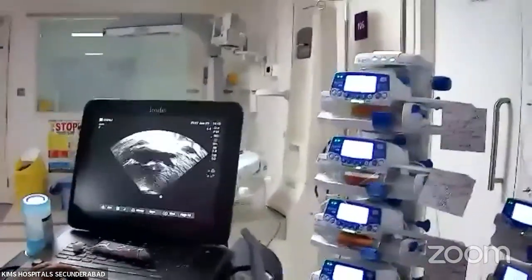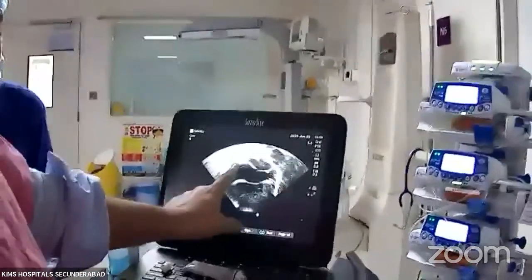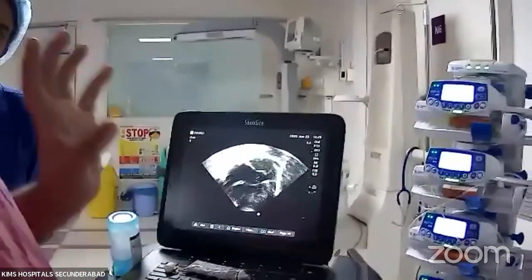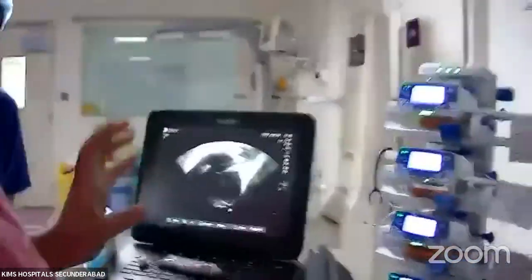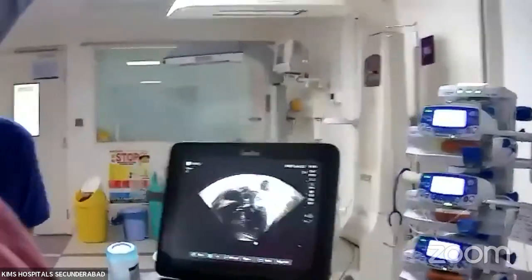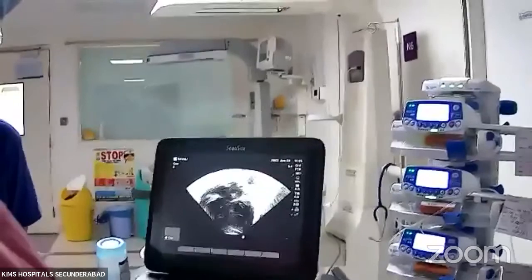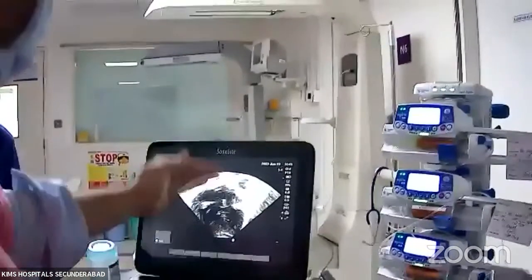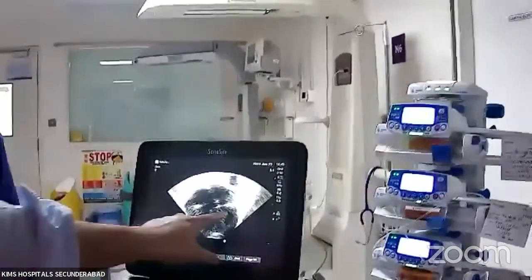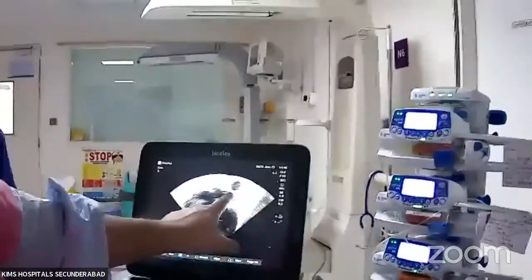Okay. In the same way, if you see the subcostal, the IVC is coming to the right sided chamber. So that means in all cases, whichever chamber the IVC is coming to is the RA chamber. And you can see the flap. I will show the flap is not seen here on the right. And now, so these are the four chambers. See. This is more septophilic, more apical, more trabeculated, and has the moderator band, this is the RV. And this is the LV. This is the false tendon. This is the LA. This is the Eustachian ridge and the pulmonary vein.